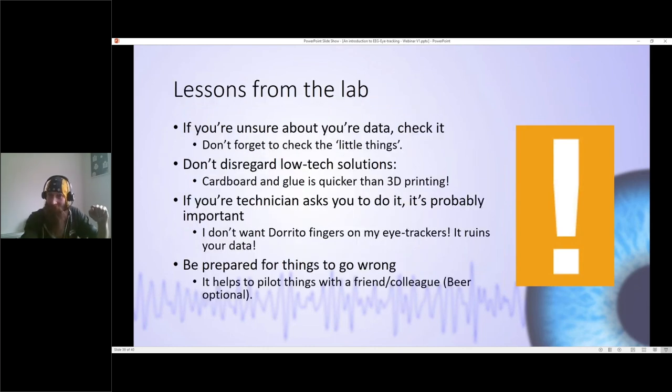And finally, some general lessons from the lab. If you're unsure about your data, check it. It's easy to forget little things like unplugging a charger or something like that. Don't disregard low-tech solutions. I found that cardboard, glue, and tape can be much quicker and more useful tools than waiting to have access to a 3D printer, for example.